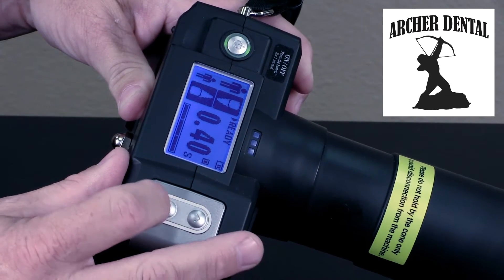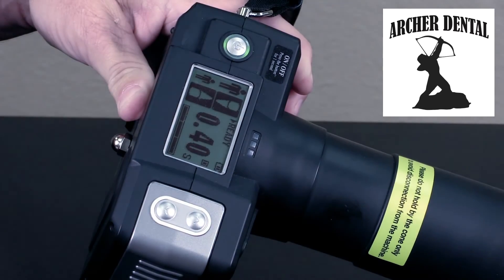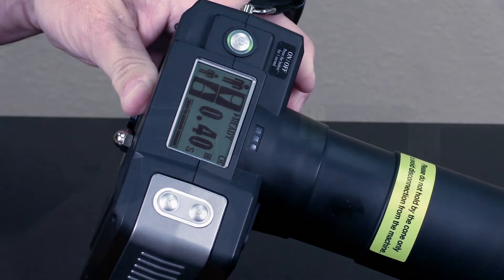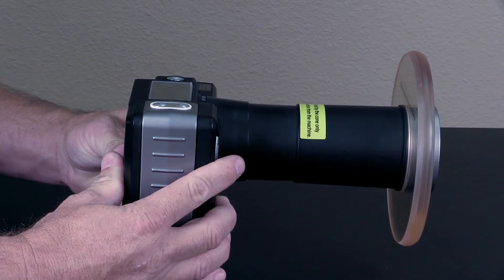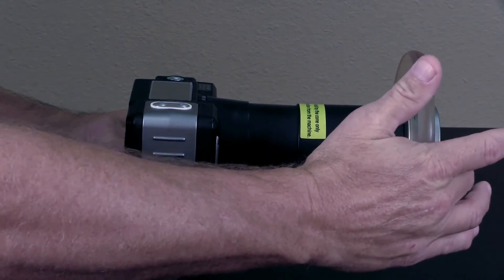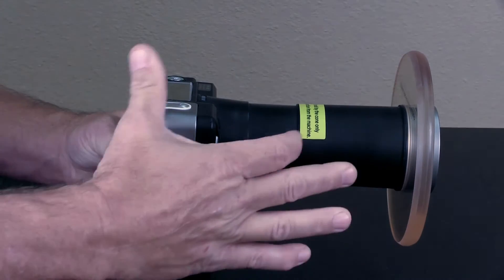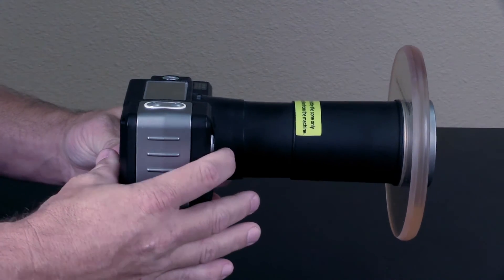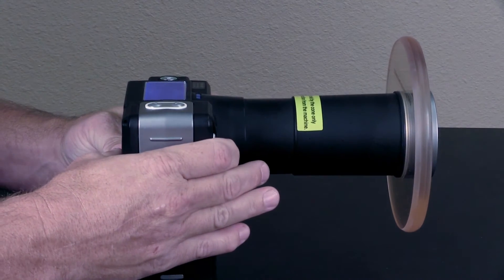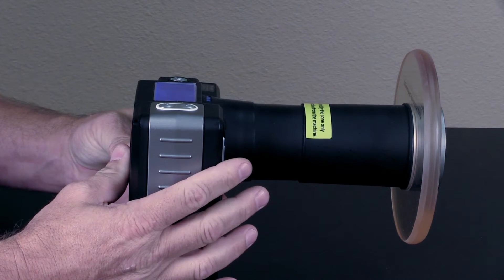Because this is a low-dose 60 kV machine, you'll find that with most sensors you'll need a very low dose to take a quality x-ray. When you're ready, line the unit up with the patient's cheek — generally about one inch or closer. Push and hold the trigger button down until it completes its sound. You've just taken an x-ray.